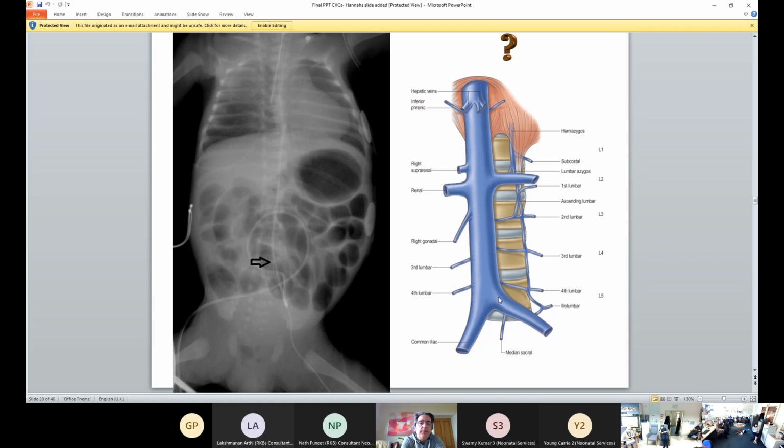So this diagram shows, when I said that if you put a long line in the left leg, it has to go up to join the iliac veins, and then cross the midline to ascend in the inferior vena cava. If it didn't cross the midline and continued upward like this, it means it has gone through lumbar veins, as you can see. And lumbar vein is very dangerous as well, because lumbar veins can cause paresis. It will affect the spinal cord very seriously.